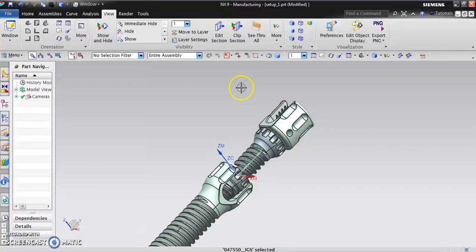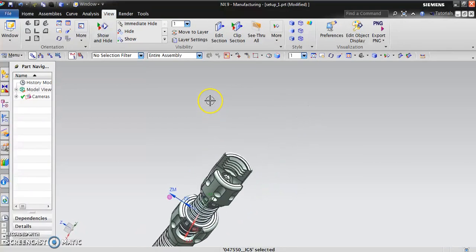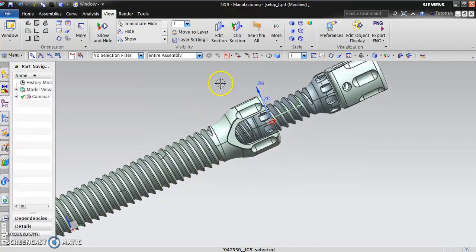It's highly critical that you understand every single feature, how to design it, and how to make it, in terms of CNC turning or CNC milling, EDM, and other manufacturing processes out there to make these components. In my videos, I like to keep it short and sweet, 6 to 7 minute videos. I've been covering how to design a screw, how to make a taper screw, how to make double lead threads. All these elements add up to making a multi-lead screw system. If you have more questions, you can direct message me. I can help you out with the important aspects and attributes in designing these implant systems. As you can see on the screen, we can pull out those components that make up one of the common systems of spinal implants.